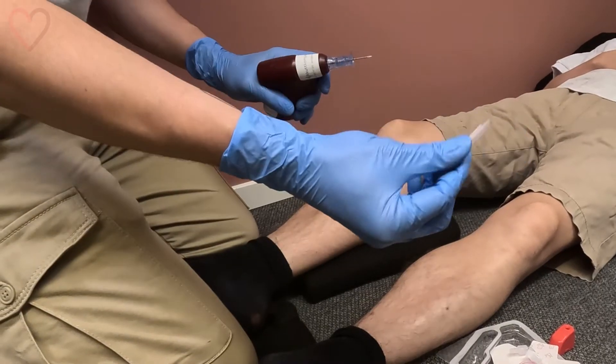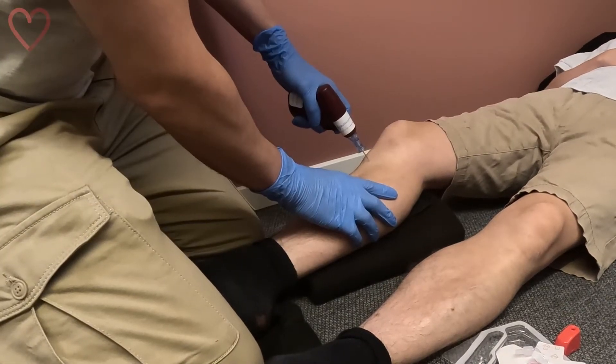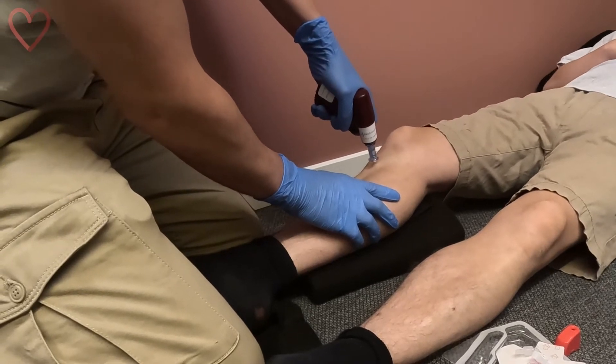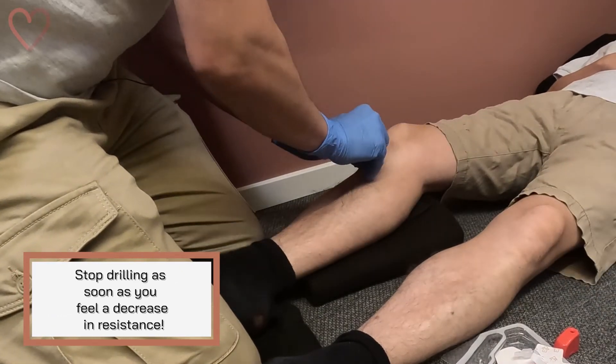Attach the needle magnetically and remove the protective cap. Push the needle down through the skin until you hit the bone and then start drilling — firm but controlled. You know you've entered the intraosseous cavity when you feel a decrease in resistance.